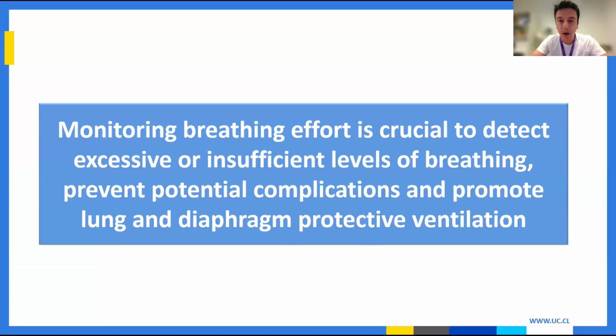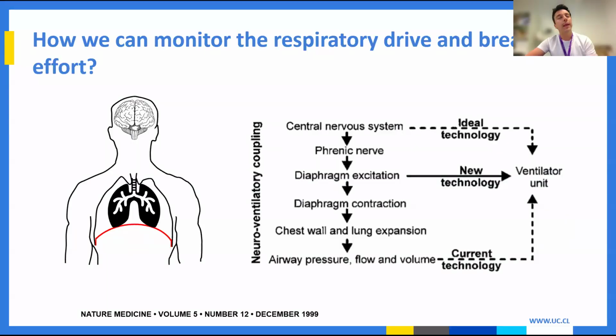So, having said all of this, we can say that monitoring breathing effort is crucial to detect excessive or insufficient levels of breathing. Therefore, we can prevent potential complications and promote lung and diaphragm protective ventilation. So the next question is how we can monitor the respiratory drive and the breathing effort. And to understand that, we need to first look at the neuroventilatory coupling.